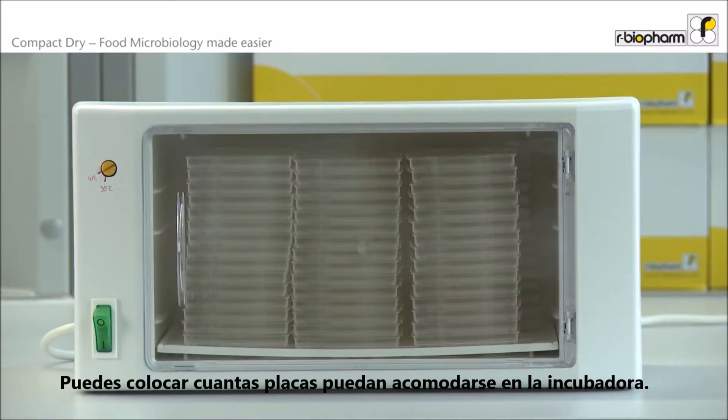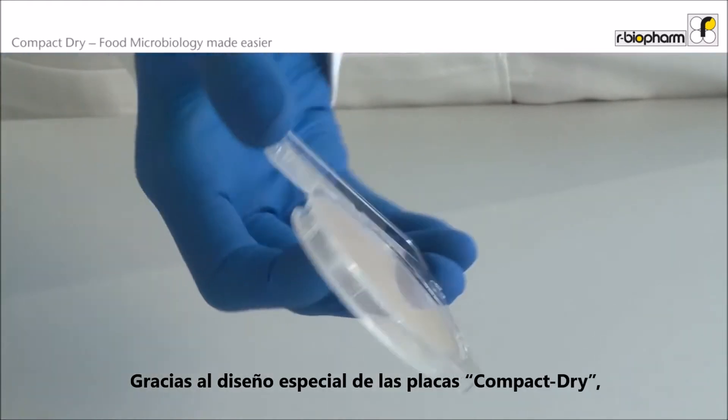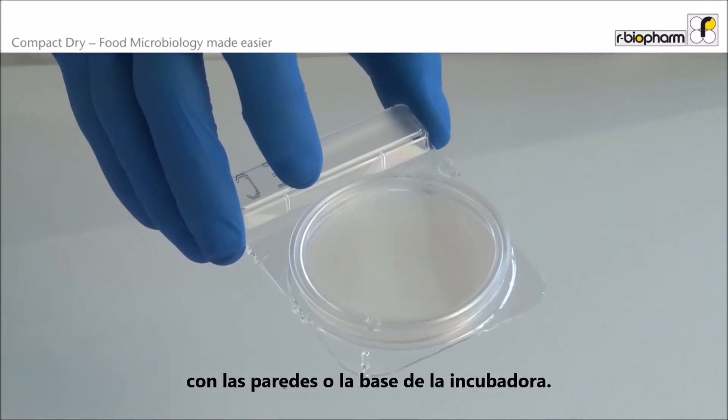You can stack as many plates as will actually fit in the incubator. Thanks to the special design of the Compact Dry plates, there is no direct contact possible with the walls or bottom of the incubator.